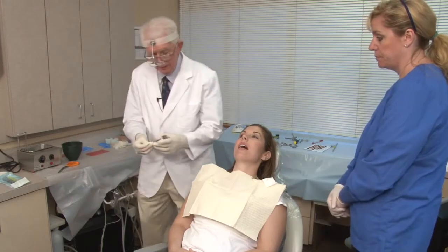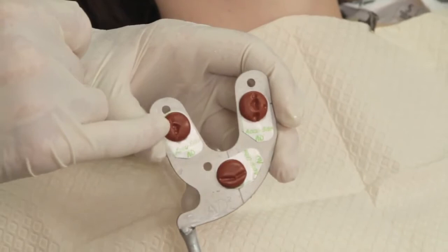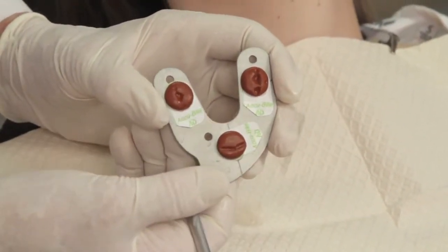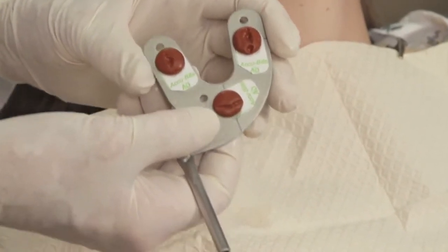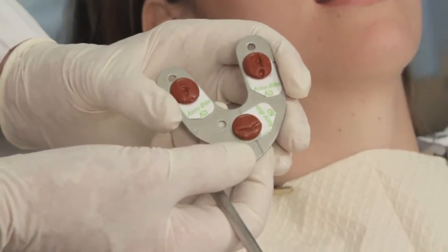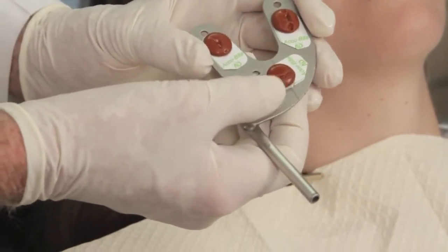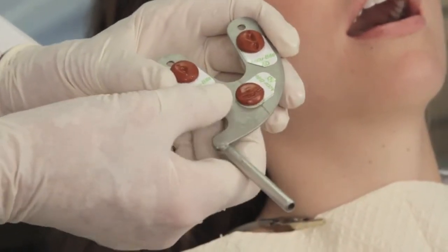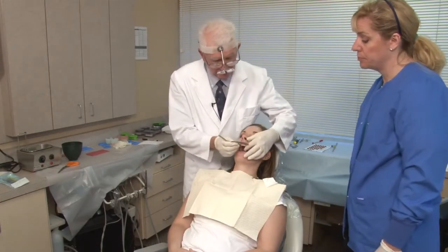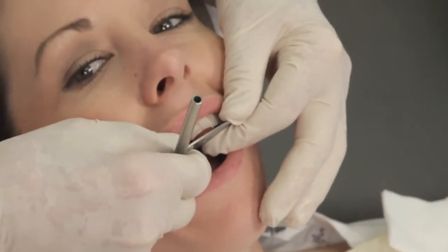Now, again, it is very important. Notice that I only have cusp tip indexing. The cusps are not seated deep into the compound. If they were seated deep into the compound, I've got to take a sharp scalpel and remove part of the compound. I will demonstrate that for you, what you have to do. That would be the very next step, is to get rid of the excess compound. But first I want to check it on the teeth to make sure that I did a good job. It goes to one place and it seats very firmly.